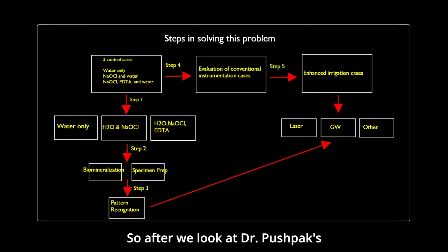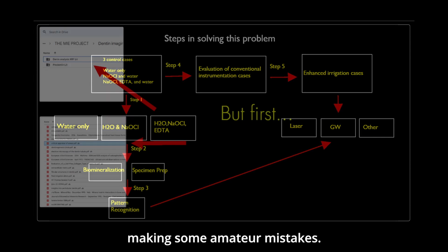So after we look at Dr. Pushpak's conventional cases, then and only then will we look at the enhanced irrigation devices of laser and GentleWave, and perhaps some other devices as well. We can never eliminate error, but perhaps we can avoid making some amateurish mistakes.